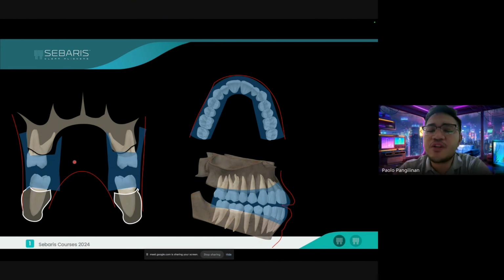Secondarily, I'm just gonna fix your alignment. We may need to use aligners or fixed appliances towards the end, but if the objective is satisfactory, you might not need to go to the next stage. So I tend to stage it this way. Again, staging for me transcends not just aligners. Staging for me is actually a whole treatment thing.